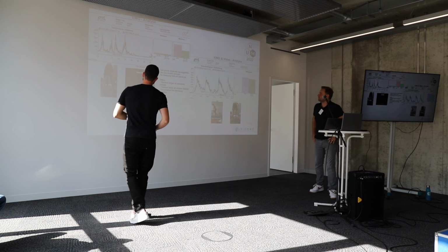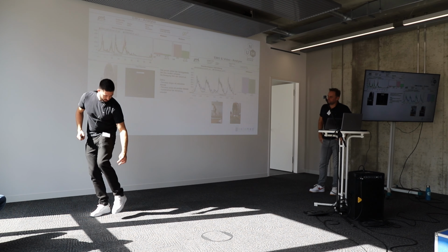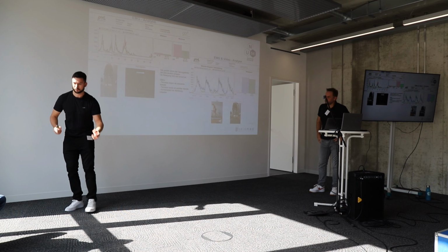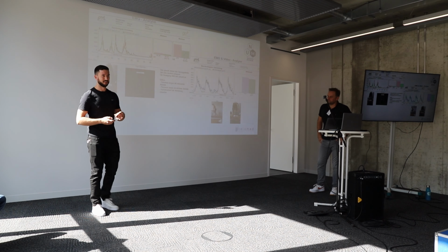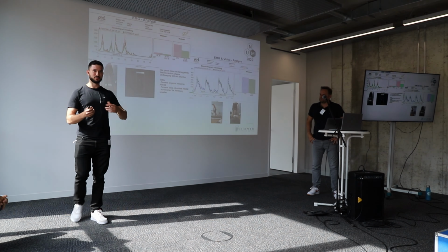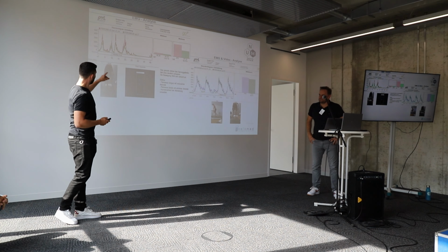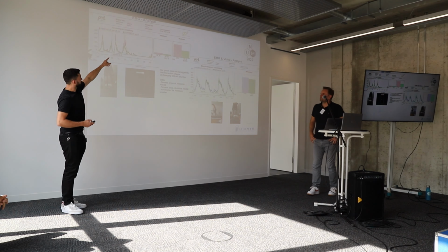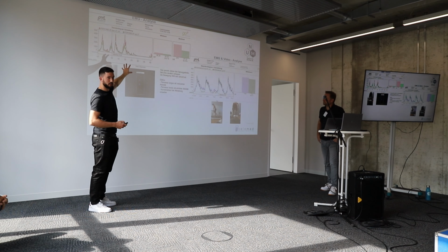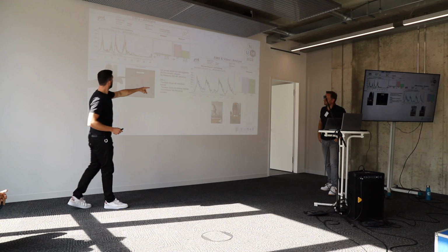And what was very interesting then to see, I gave him the peroneus longus and the peroneus brevis. We discussed it. Actually, the peroneus longus is too long to get to the peroneus brevis, but we can talk about this later. I named it peroneus up and low. And this is the left injured side. This is the right not injured side part.